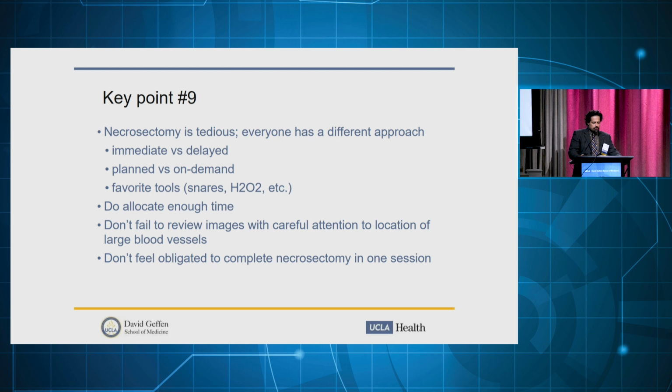Necrosectomy itself, once you get in there, I don't think anyone enjoys it. It's kind of tedious. There are dedicated devices starting to come on the market that were going to be marketed for this type of stuff, but everyone has their favorite tools and techniques. Allocate enough time. I usually say I'm going to do as much as I can in an hour and then we're done, and then come back.